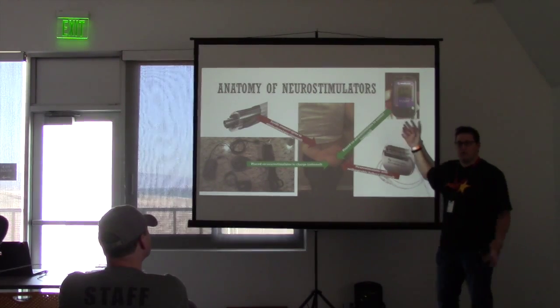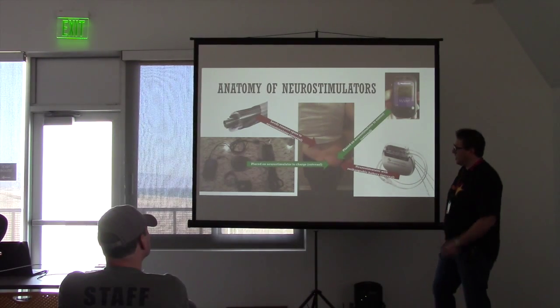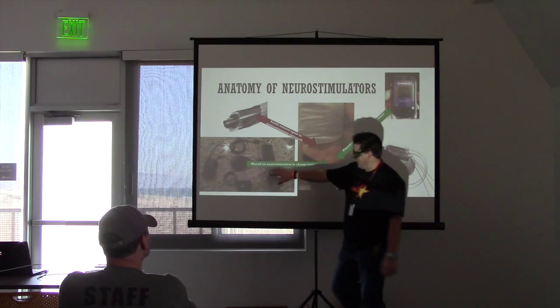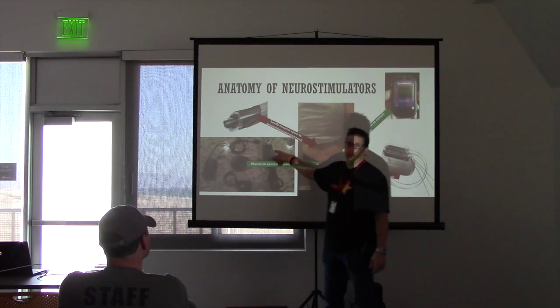The remote shows status. It's pretty small. Again, it's about the size of a pager. You just carry it in your hand. And then this is the charging unit, and I'll show you guys later. I actually have it here if you want to look at it. The charge is a magnetic charge. This is a battery pack that you can use with it, and you actually plug it into the wall.